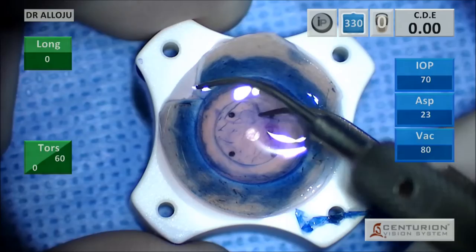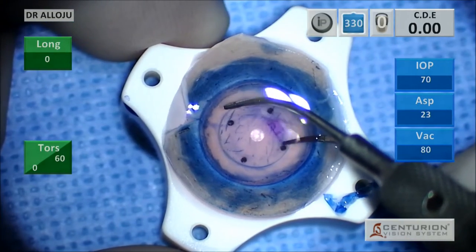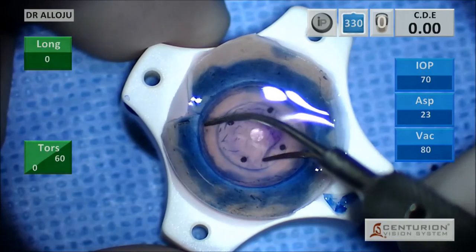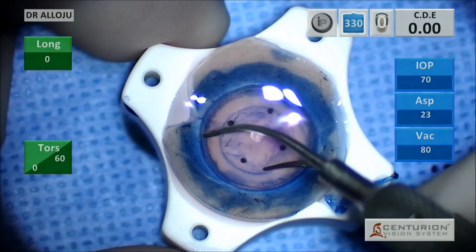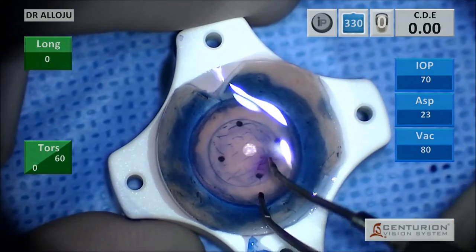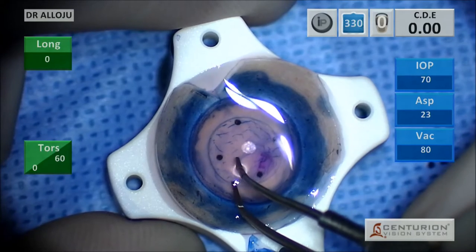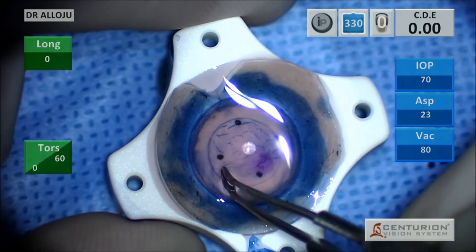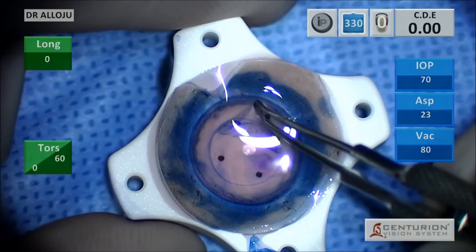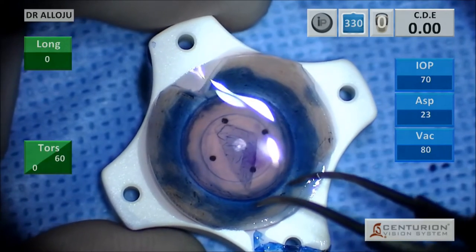Now what I like to do is open the curved tying forceps here and get underneath the graft to make sure that it is truly separated completely. I've heard many stories where the graft is actually torn because there was an edge that wasn't completed, and I like to actually tear in a circumferential manner rather than lifting all the way off.